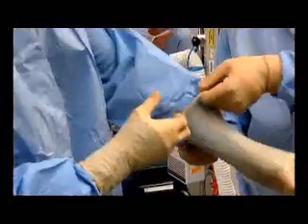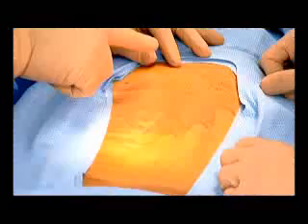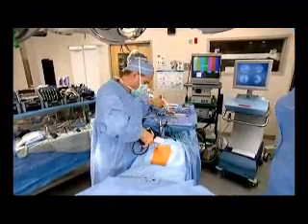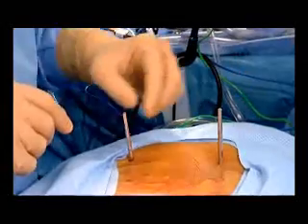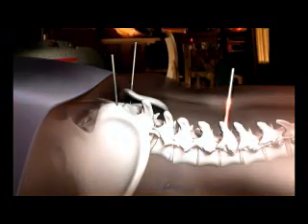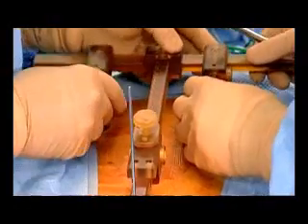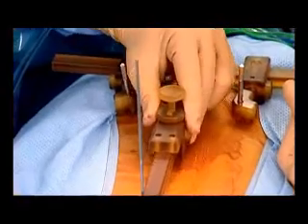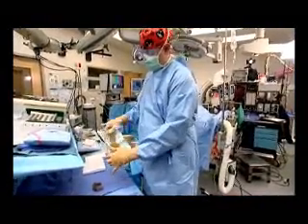As the operation starts, the surgeon prepares for the mounting of the T-frame to the patient's spine. It is attached to the patient's bony anatomy by two incisions at the posterior superior iliac spine and one guide wire to one of the spinous processes. The T-frame now hovers over the patient's spine. Next comes real-time automatic image-based registration.